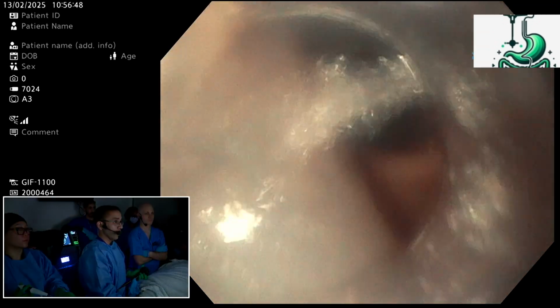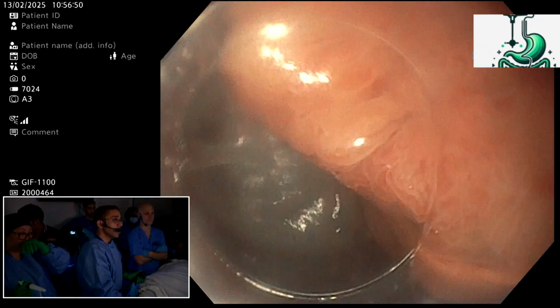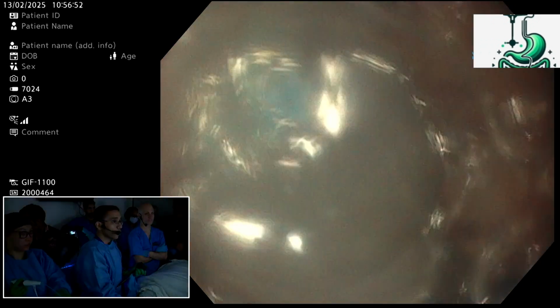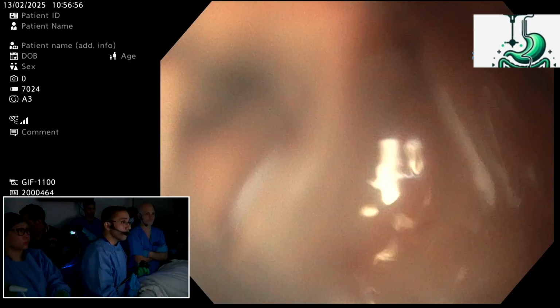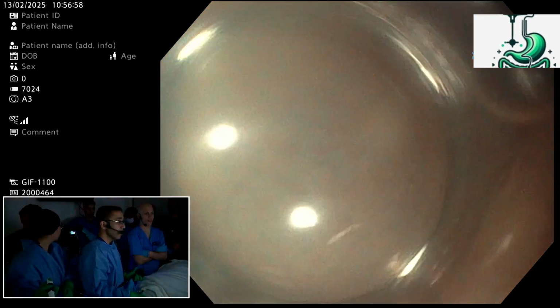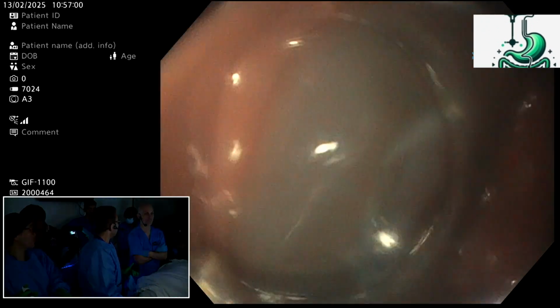The setting we use here is Endocut I 2-2-2 for the incision, and we'll use Precise Sect 4.5 for dissection. I don't know what is your setting and what you recommend for this.